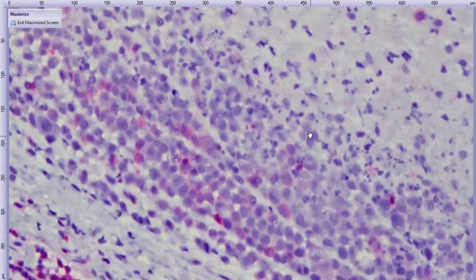I think this is either going to be some sort of aberrant staining, something weird about the stain. I could potentially repeat this one too, just to make sure it's for real. Or there are some plasmacytomas, plasma cell tumors, I should say, probably more likely plasma cell tumors, multiple myeloma type situations that have aberrant expression of CD3 in the neoplastic cells, and that is also a possibility in this case. But given that the vast majority were negative for CD3 and positive for MUM1, plus the morphologic features, the plasmacytoid morphology and the frequent multinucleate cells, this is myeloma-related disease, plasma cell tumor, something along those lines.